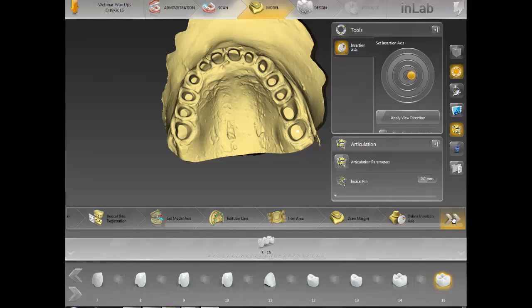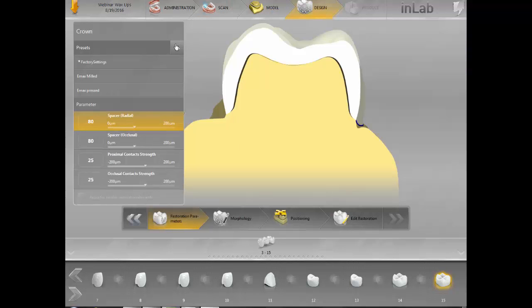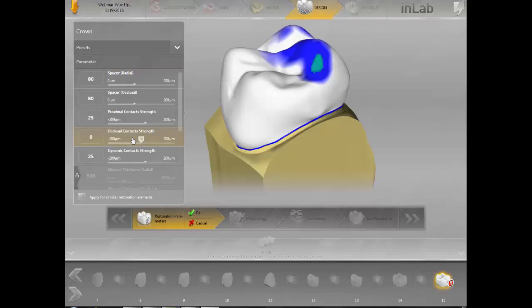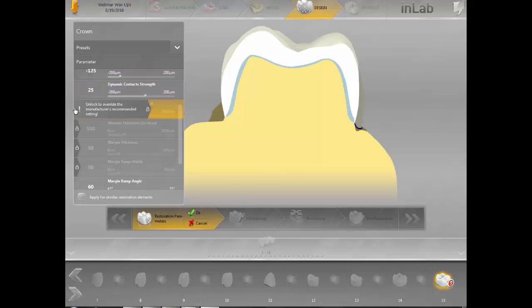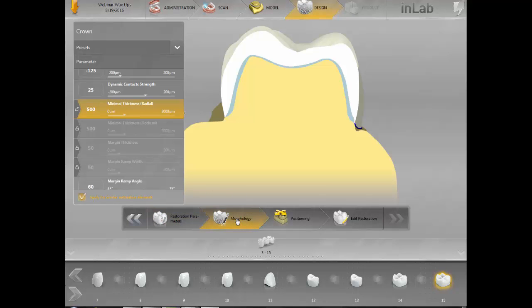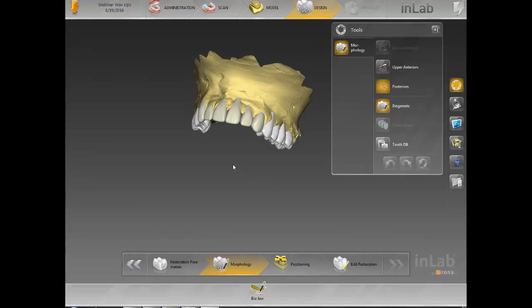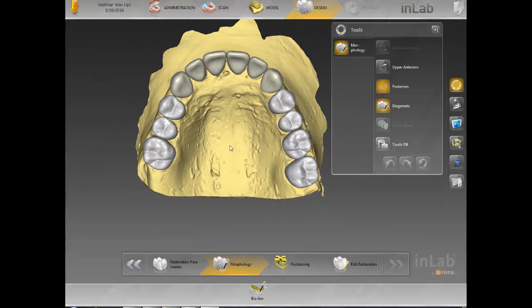After we do that, we double-arrow forward. Normally you already have all your parameters preset. But if you're doing wax, the spacer just needs to be tight. I normally glue these to the models anyway. I'll just move a little something so this lights up, click 'Apply to All,' then click OK and move on to the next step. Because I set all those dots exactly where I wanted them, my initial biojaw setup is usually almost dead on. So I'm actually almost done with the case when I get to this phase.